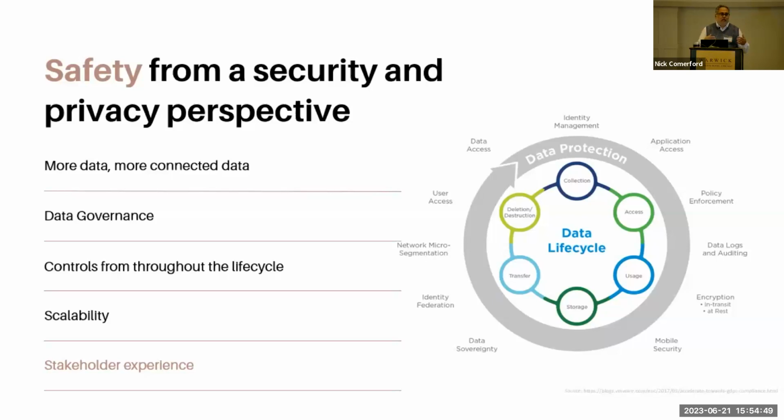When you start working with data and connected systems, almost everyone starts off with human in the loop. It's humans managing privacy, humans managing access controls, humans manually creating and deleting patient data, humans manually de-identifying patient data. So to solve that scalability problem, you start having to build tools that manage that work. Most of those tools are going to have dashboards.